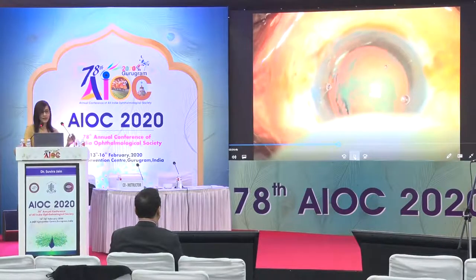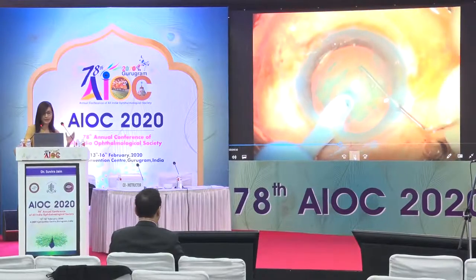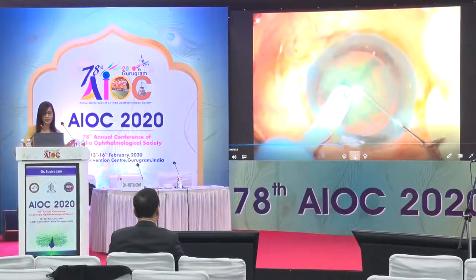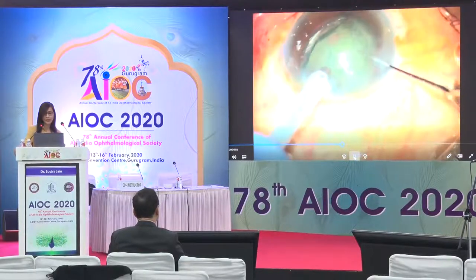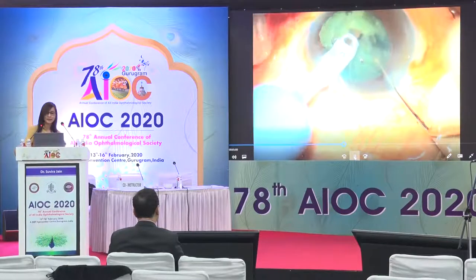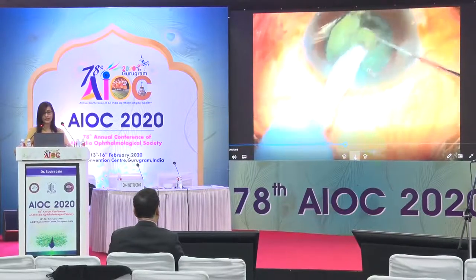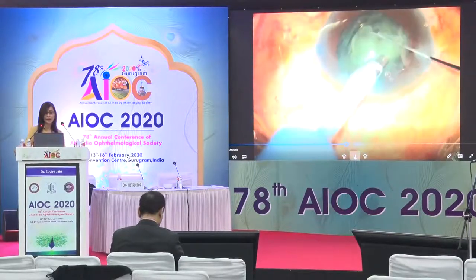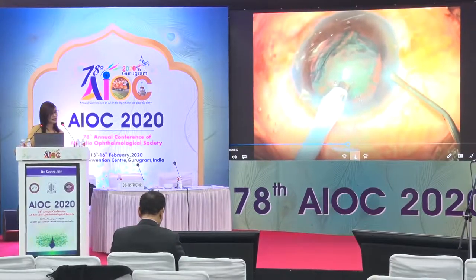As cataracts get harder, hydro-delineation may be a little challenging, but having achieved the best delineation possible, you do a direct chop with limited lateral separation. The surgeon attempted lifting a fragment — it didn't come up — so a tiny chop was performed on the other side, removing a fragment, after which subsequent emulsification is like any other case. The main thing is to keep your settings controlled and keep it gentle.